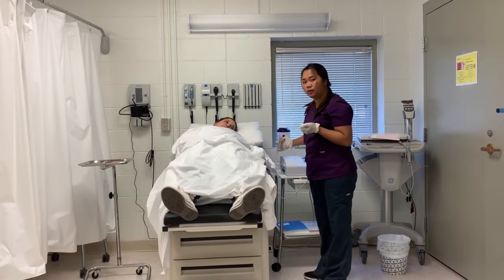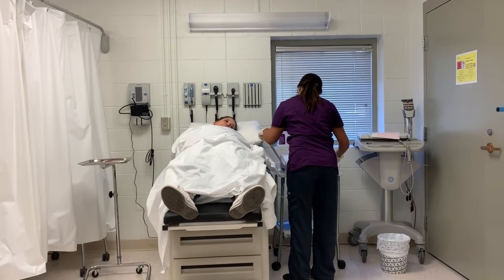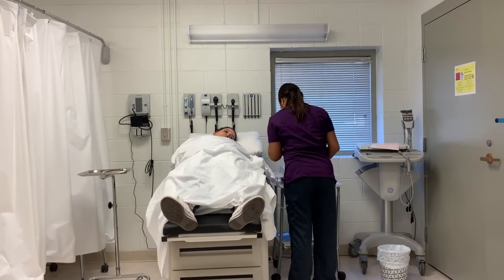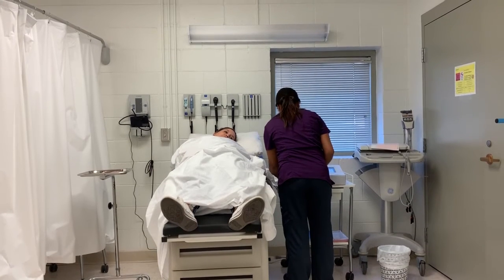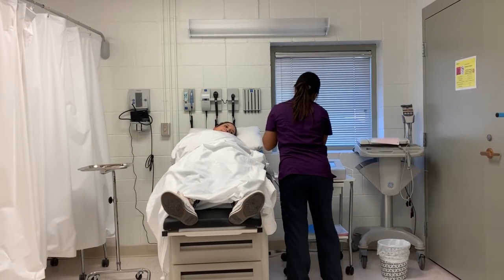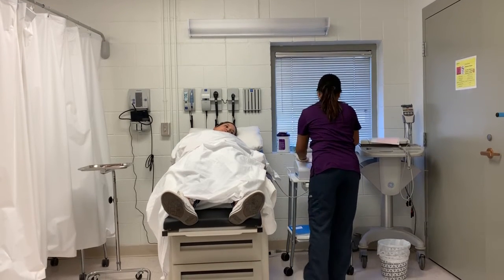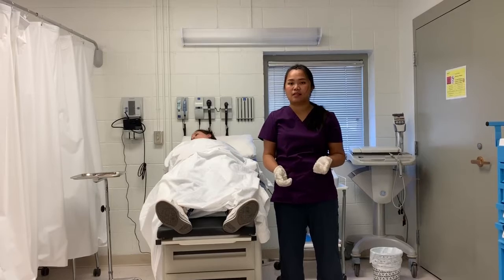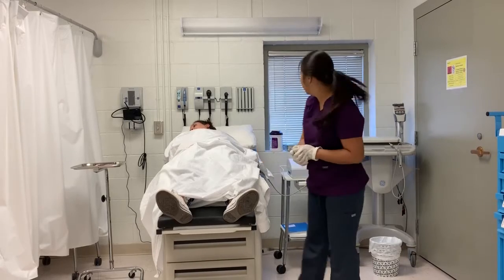I'm going to go ahead and print another one for the physician to review, and the other one will be on file for the patient. Now that we've finished the test, I'm going to go ahead and remove the lead wires and electrodes and clean the patient's skin.